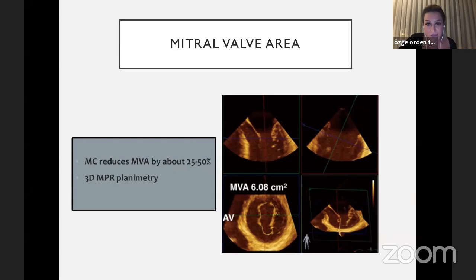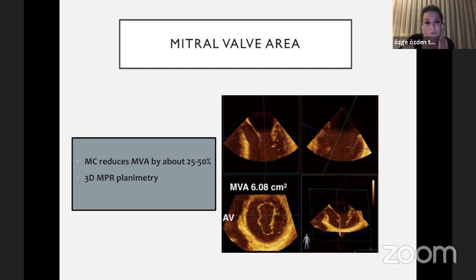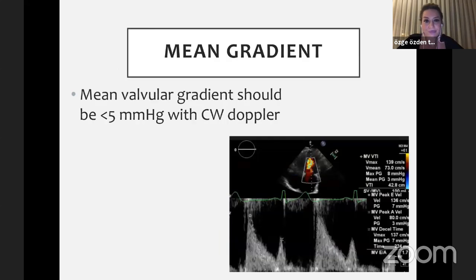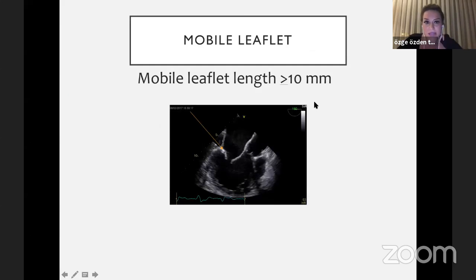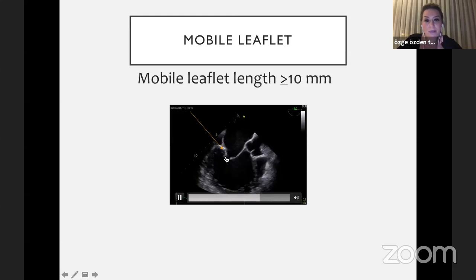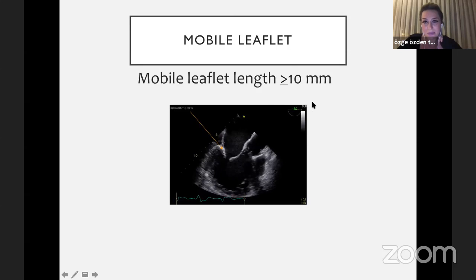We measure mitral valve area with the 3D MPR method. Mean valvular gradient should be less than 5 mmHg with CW Doppler at baseline and after each clip. The mobility of the leaflets — especially the posterior leaflet — should ideally be at least 10 millimeters. Here are some examples from our clinic: if we have severe mitral regurgitation and we don't perform 3D imaging, we cannot understand the morphology and anatomy of the mitral valve.